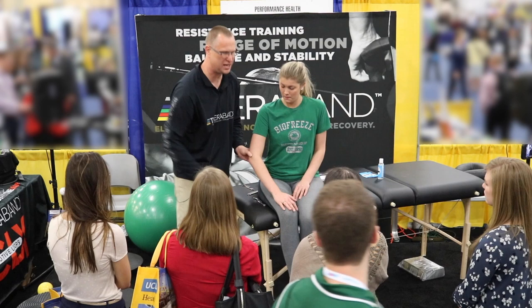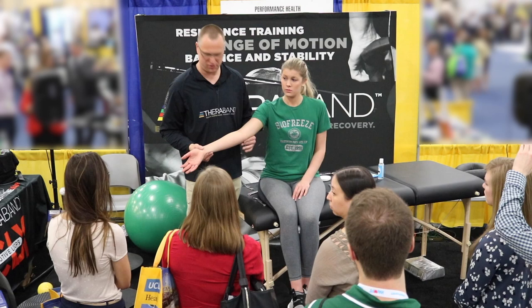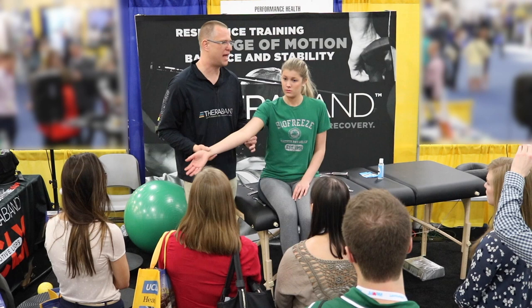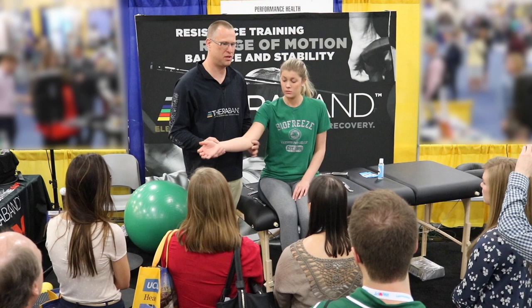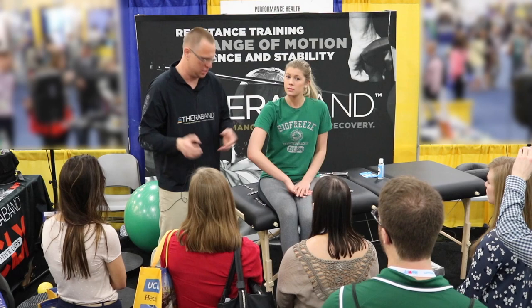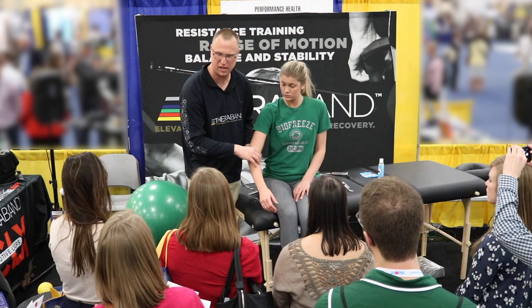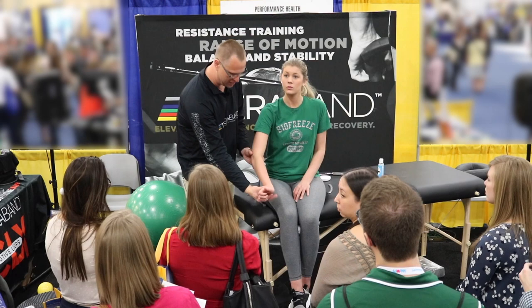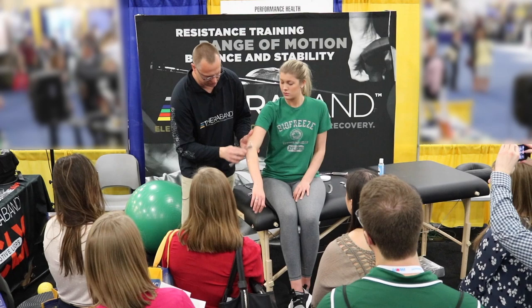For lateral epicondylopathy, let's think about the mechanics of a dysfunctional elbow. Almost always there will be some limitation in elbow extension. What we typically find in the clinic with lateral or medial epicondylopathy is a dysfunction in elbow extension — because of primal movements like lifting, pushing, squatting, and pulling, the triceps gets very aggressive. The other key component is over-activation of the supinator, making the radial and annular ligament tender, which causes excessive use of the common extensors, resulting in diffuse pain through them.